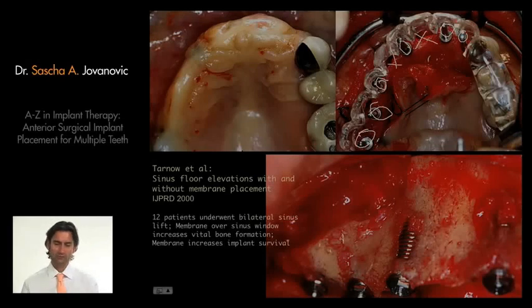Of course, it also makes a little bit of a difference where I place the implants, so I have the maximum amount of bone, because I don't want to do too much surgery, especially not in an elderly patient. So sometimes you move the implants. That's why we need a surgical guide stent according to the bone available. So we're going to try to do as little bone grafting as possible, depending on the amount of bone which is there, and then we can shift the implants a little bit. This particular patient received in the posterior a sinus graft, which was giving bone, particularly on the 2 molars.